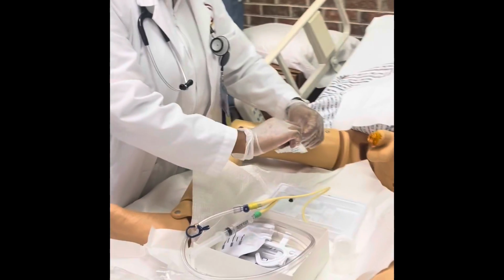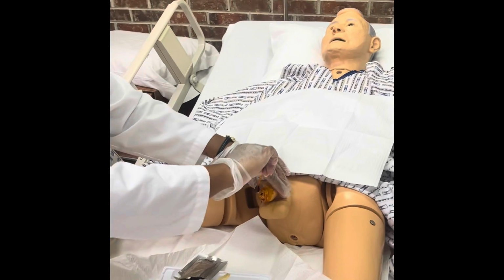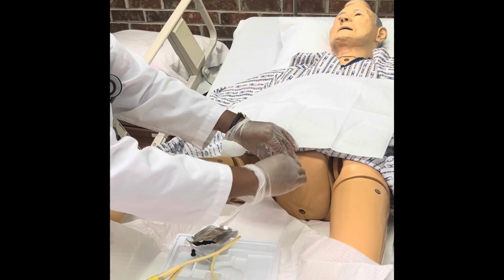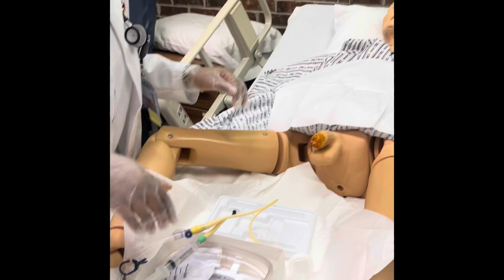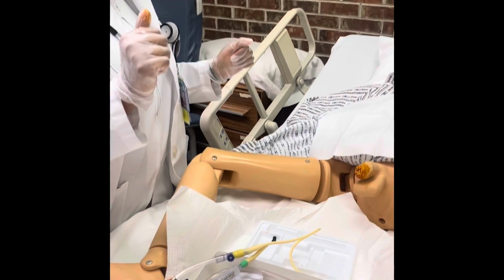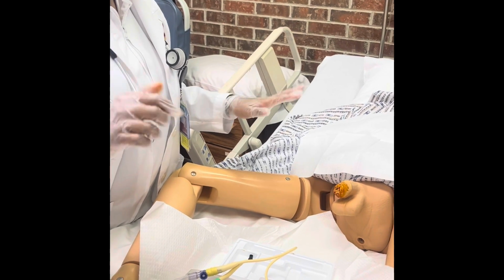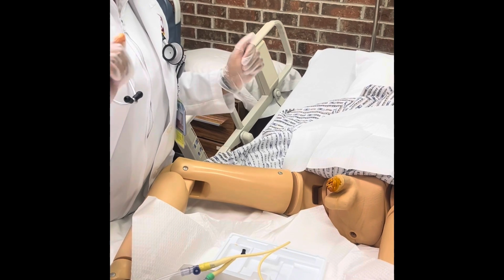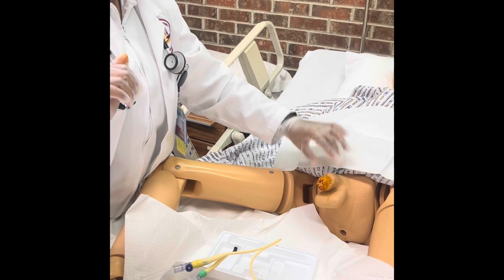And then the last swab. And trash that. All right, Mrs. Smith. Now I'm gonna get ready to. Okay, the whole time that I'm touching him with this hand, I'm making sure not to touch anything else with that hand.